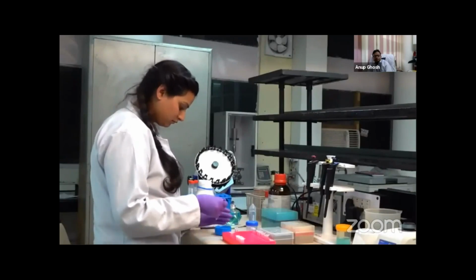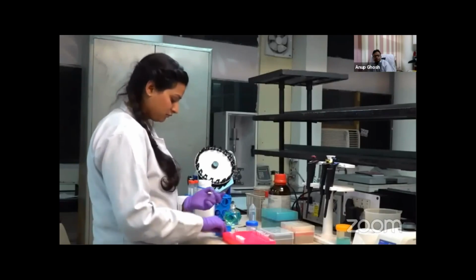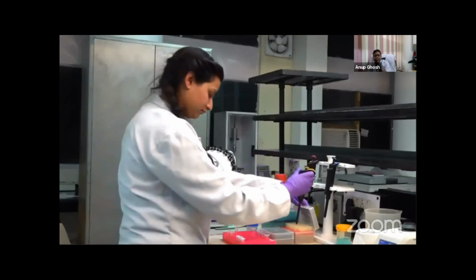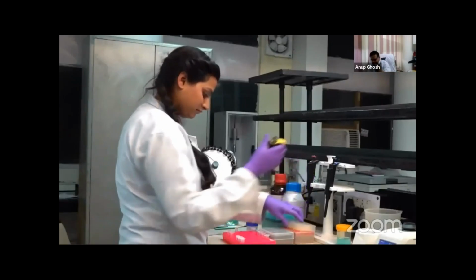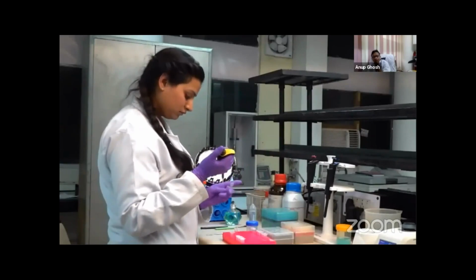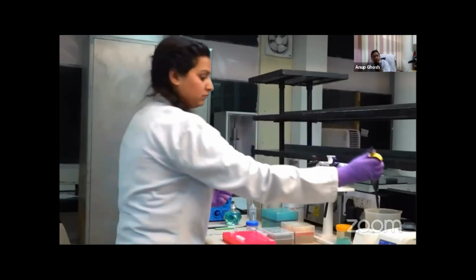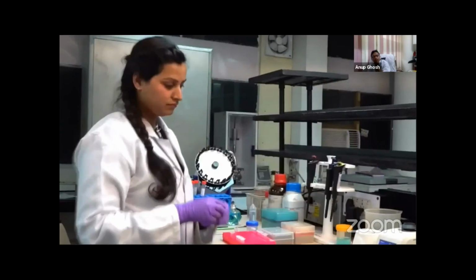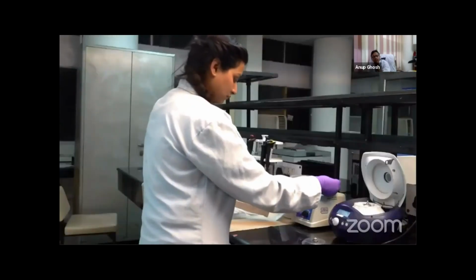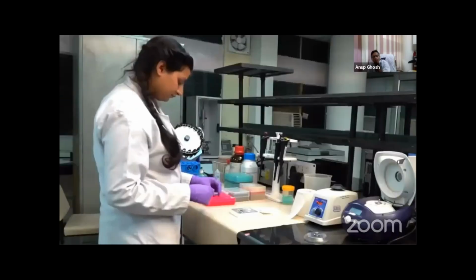We will then add glass beads, 0.5 mm in size, acid washed. The quantity of glass beads must be equivalent to the volume of the original pellet size. Then we will add an equal volume of acetonitrile as formic acid, that is 50 to 80 microliters. This suspension should then be vortexed vigorously for at least 10 minutes. This ensures proper lysis of the molds.